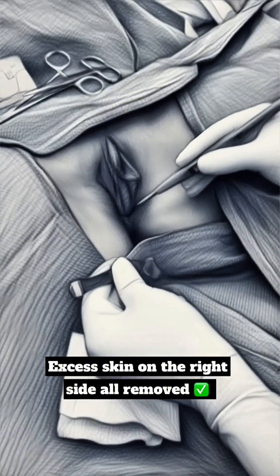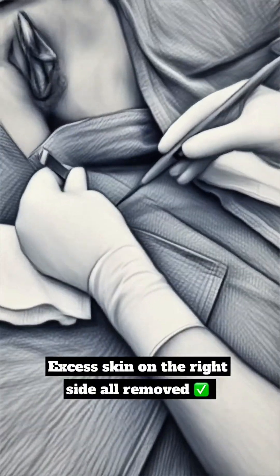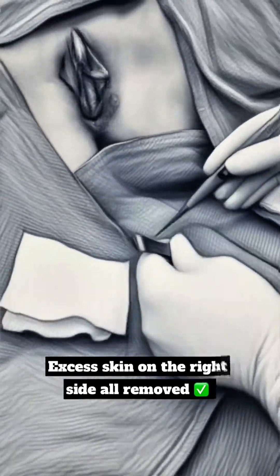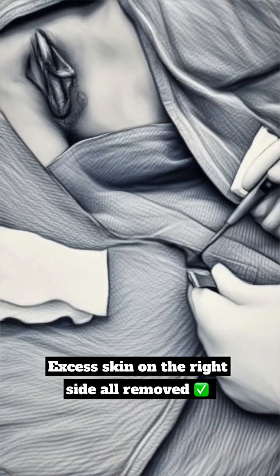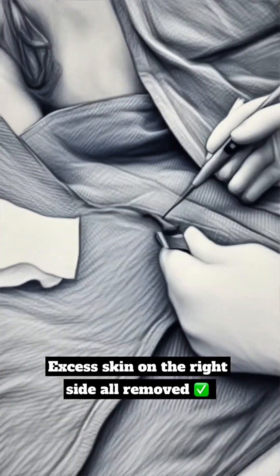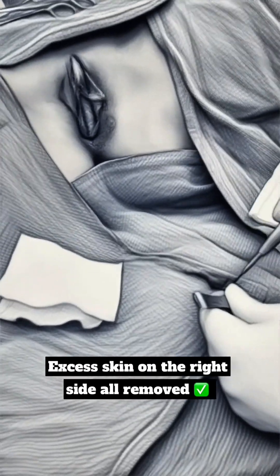We've removed all of this. There is the excess tissue that's been removed — it is not a lot, just enough to make a difference. This is just the labia part, the middle labia, the finger-like projection. And this is the anterior extension that was over the clitoral hood. You can see mostly it was anterior, a little bit posterior.